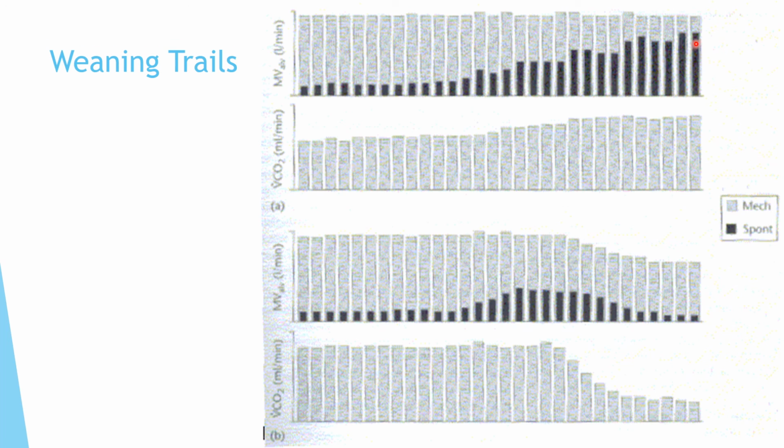These are spontaneous breaths. And then you can see your CO2 increase. So the patient's breathing on their own, doing pretty well. Patient in bed 2, though, you can see they're breathing, and they peter out. And their CO2 also peters out. So this patient's able to be extubated, or I guess that'd be a successful weaning trial. This patient, not so successful.